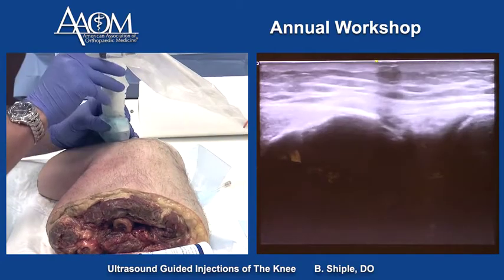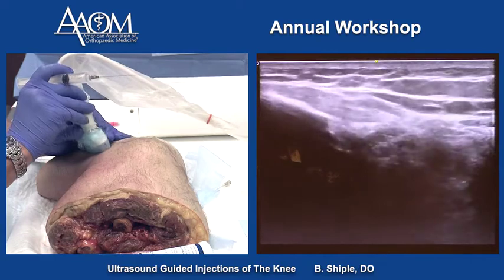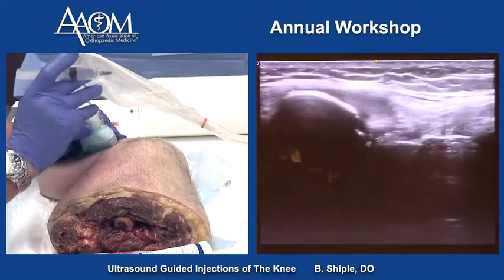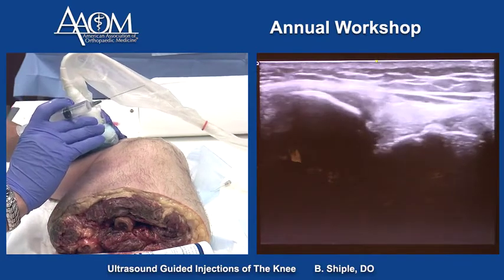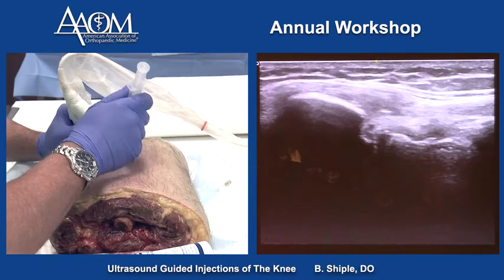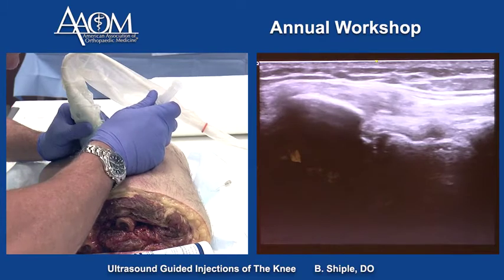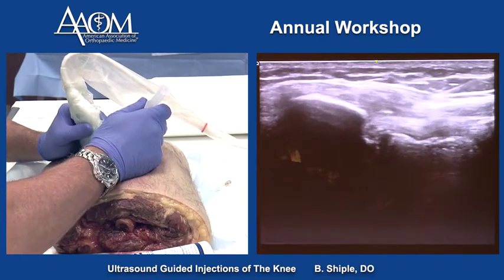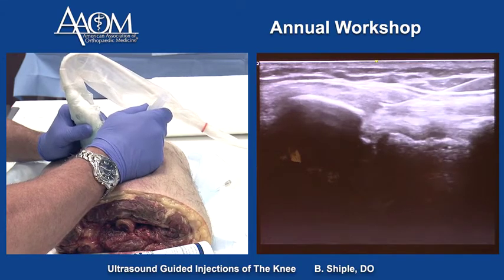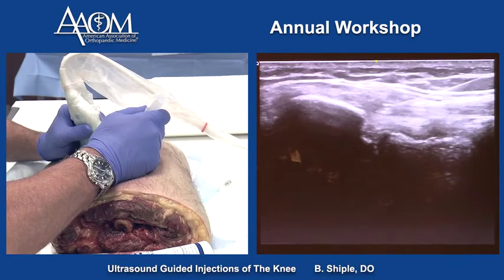We can also use a long axis technique to get the needle into the lateral collateral ligament. This is a backhand technique, more advanced, going long axis under the probe. And I'm at the insertion of the LCL onto the fibular head right there.